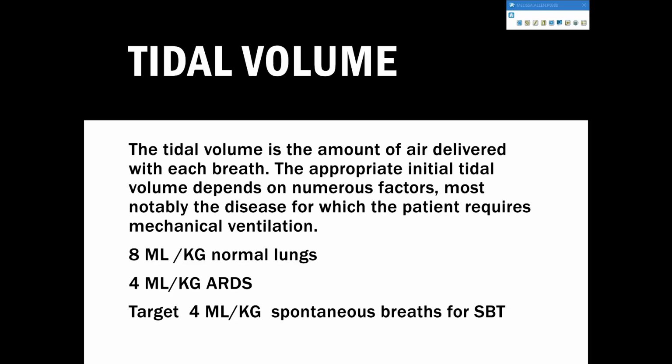If the doctor or the anesthesiologist coming from surgery gives you a setting that is too high, we need to fight for that patient and argue and say, no, this is just too much. Cardiologists are expecting us to manage those vents, and the intensivists will always back you up and do the right thing as far as tidal volume. They're all very knowledgeable, but sometimes anesthesiologists tend to be a little more old school and use higher volumes.